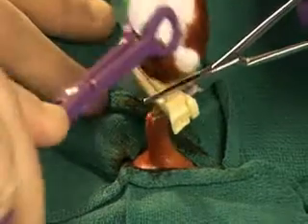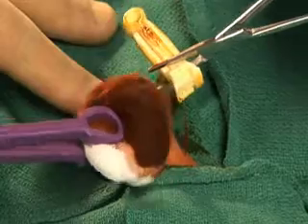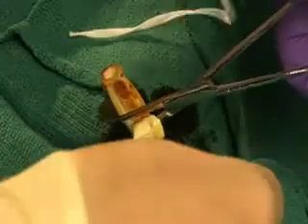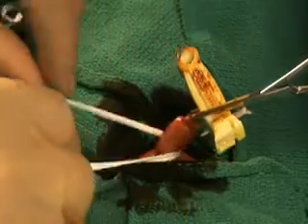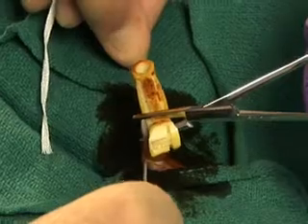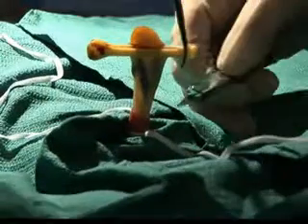Apply sterile towels or surgical drape in such a way that the patient's face is visible, then wrap the cord tie around the base of the umbilicus and tie with a single knot. The knot should be tight enough to prevent bleeding from the cord, but loose enough to allow the catheters to pass through the vessels of the cord.